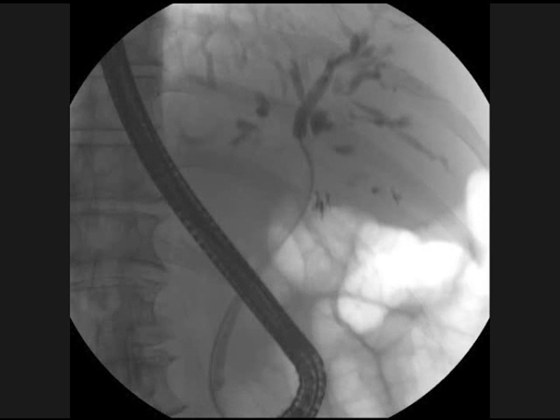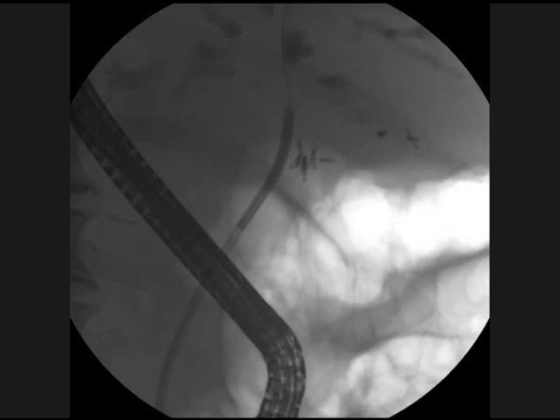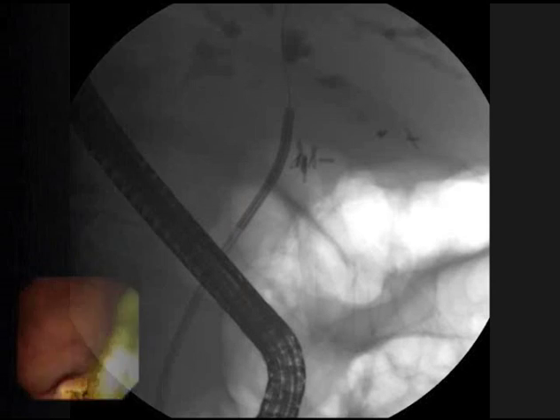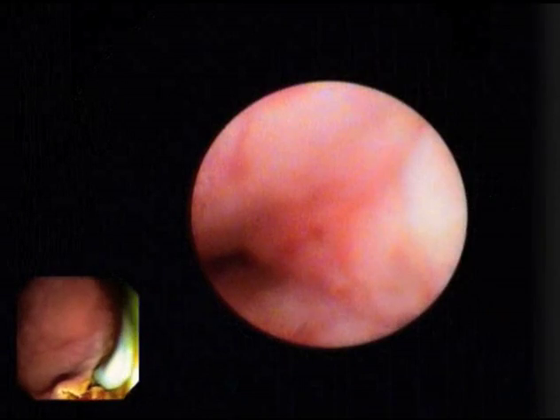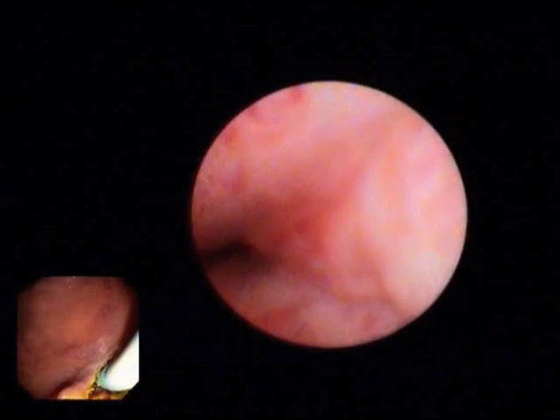We dilated the right hepatic duct with a six millimeter by four centimeter biliary dilating balloon and obtained brushings. We then advanced the single operator cholangioscope to the level of the right hepatic duct for direct observation.